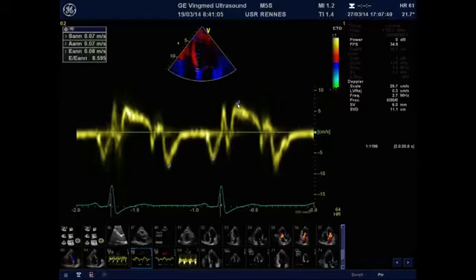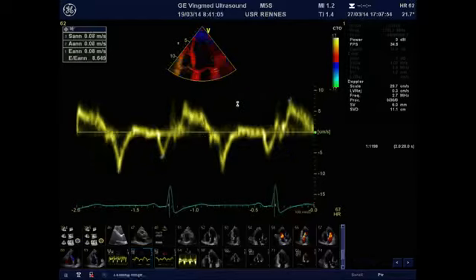But as we focus on the assessment of LV systolic function, we will just report this measurement of the S prime velocity, which is a parameter of the LV systolic function and especially of the longitudinal component of this LV systolic function. So we measure this S prime velocity at the septal part of the mitral annulus as we measure it at the lateral part of the mitral annulus.